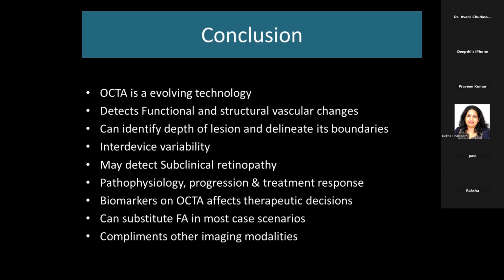I would still advise one should stick to multimodal imaging, but it can definitely replace FA in many of these things, especially in ischemic maculopathy and in detection of neovascularization, and thus this helps in managing diabetic retinopathy in a better way. Thank you. Thank you for your patient hearing. If you have any questions, I'll be more than happy to take them.